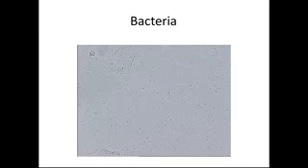So here's a picture of bacteria. It's all these little dots and slits among the slide. This person is flooded with bacteria.